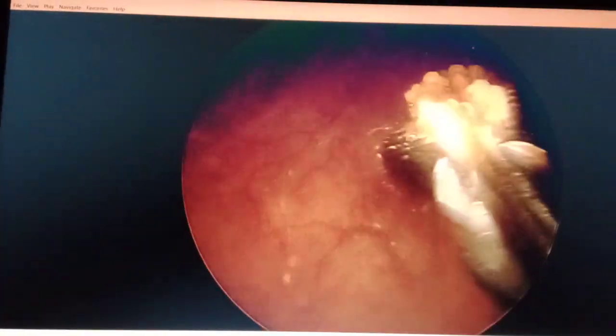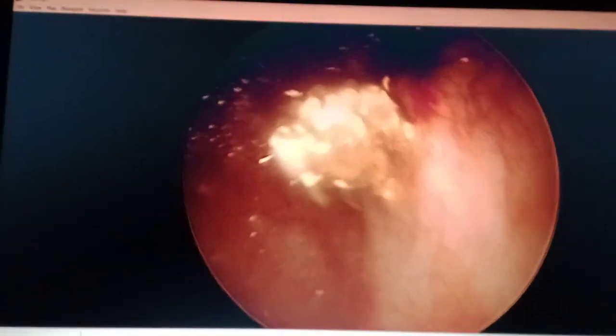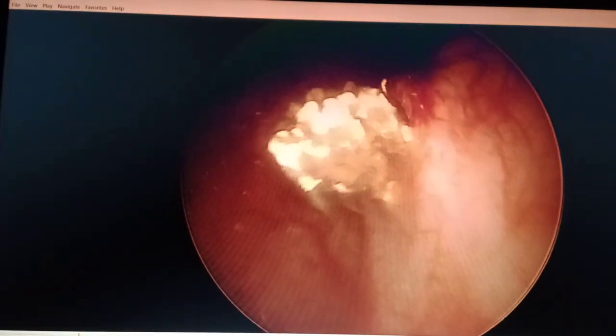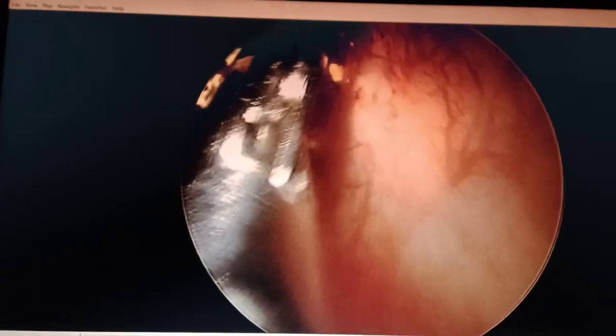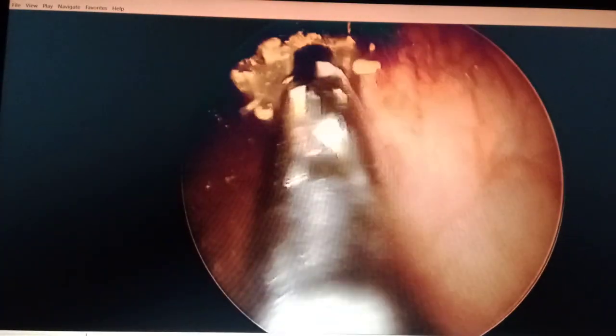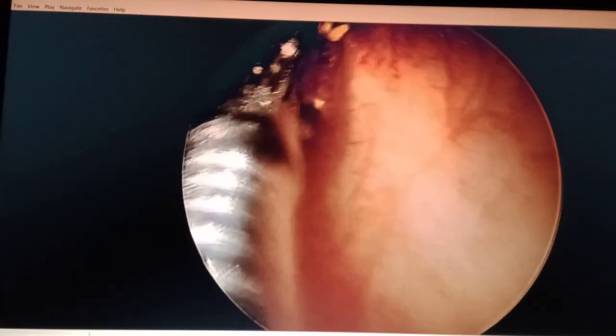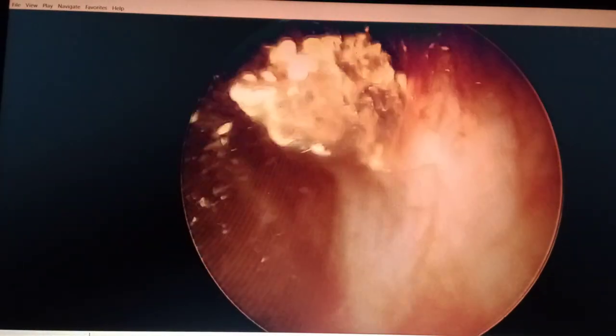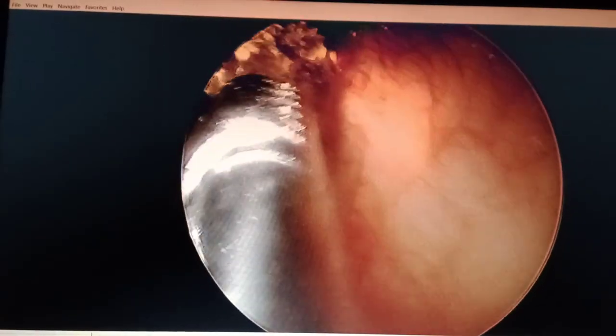We have seen the right ureter-vesicle opening as well. Since this is an obstructive system, there is no space to go inside through the left ureter-vesicle opening. It is very difficult to deal with these types of stones.